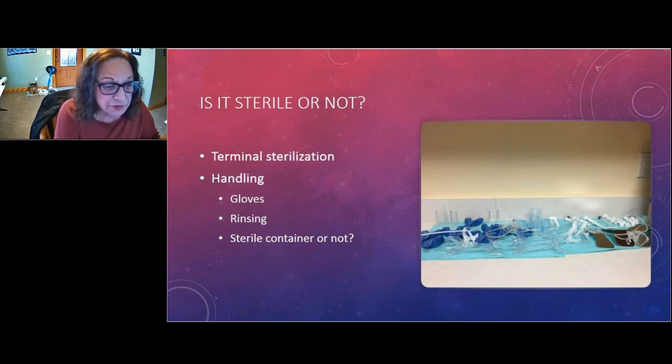And I say that very carefully because some chemical vapor sterilizers use formaldehyde, and I would be very hesitant to bring that into my practice, actually. So if the item cannot undergo steam sterilization, I would look for a replacement that could, or disposable. Again, that is the best safety margin.